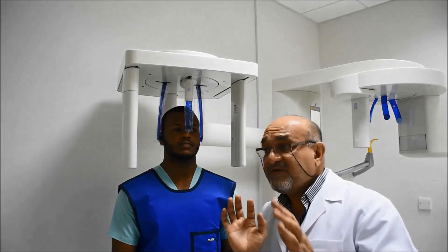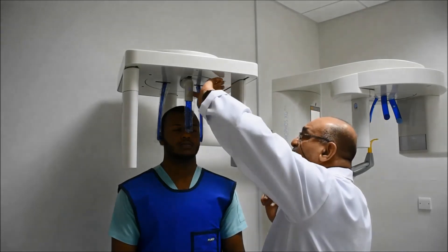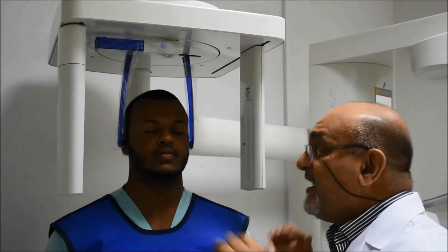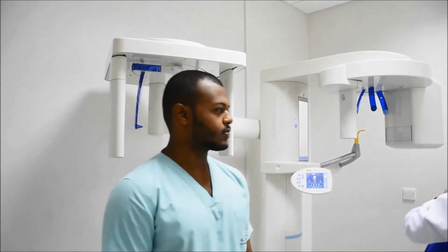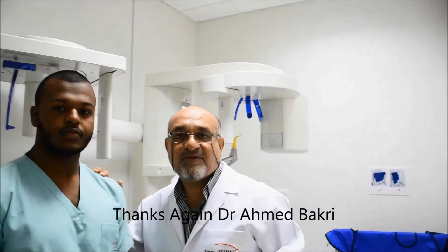Perform the exposure and watch the patient throughout the entire exposure time to make sure they do not move. When exposure is done, reverse your steps: remove the frontal stop, take out the ear olives, guide the patient out, and remove the lead apron. Hand the apron properly — and the lateral ceph exposure is complete.